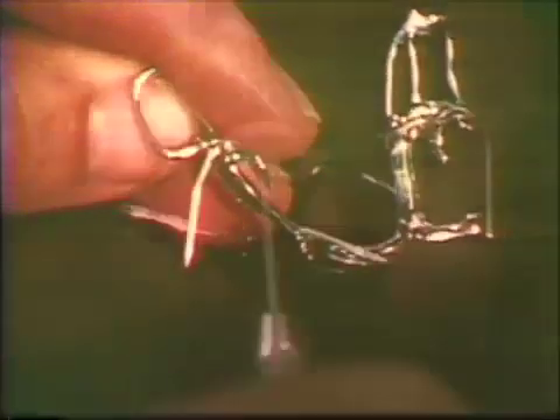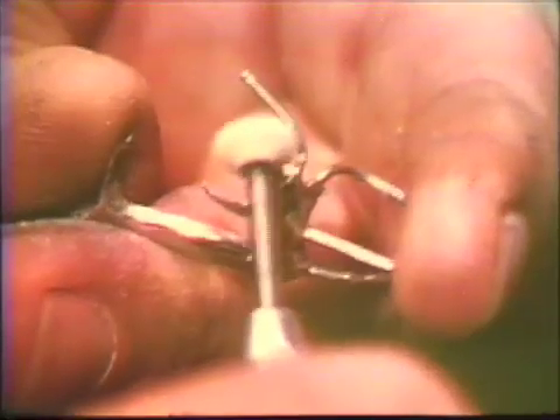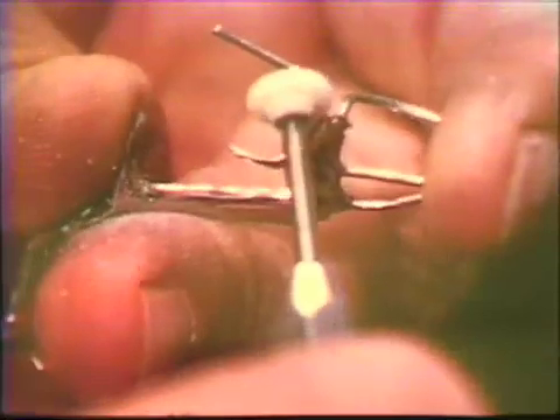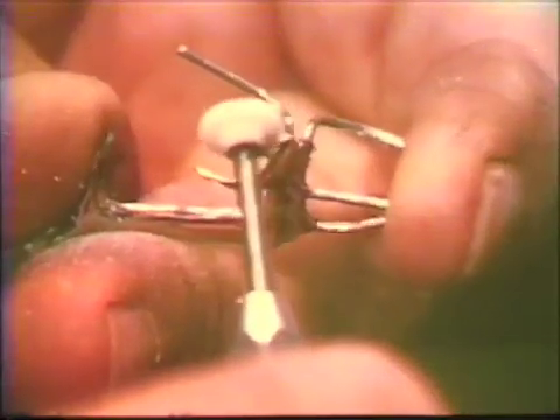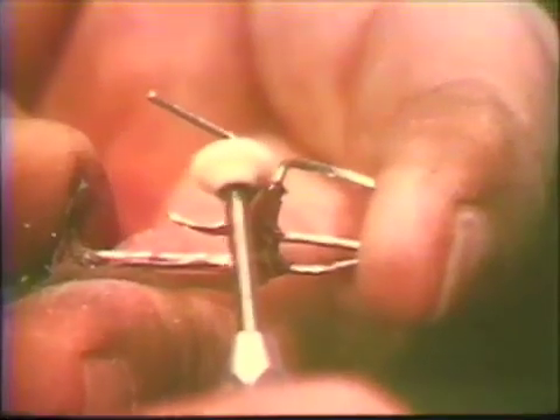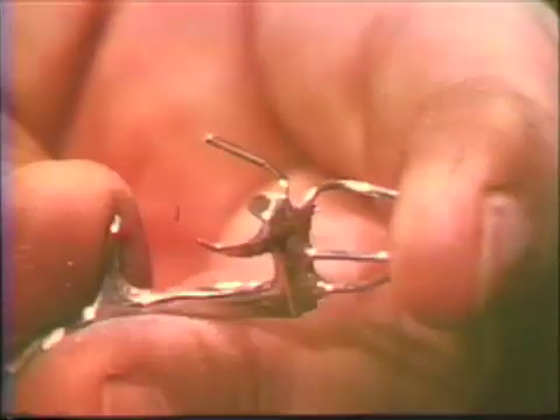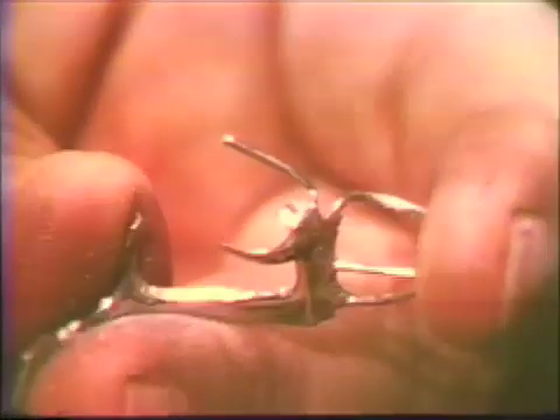The occlusal rest form should be made concave to coincide with the opposing occlusion. Suitable stones such as the number five and number eleven gemstone can be used for these minor framework adjustments, or a specially assembled touch-up kit can be obtained for this purpose.